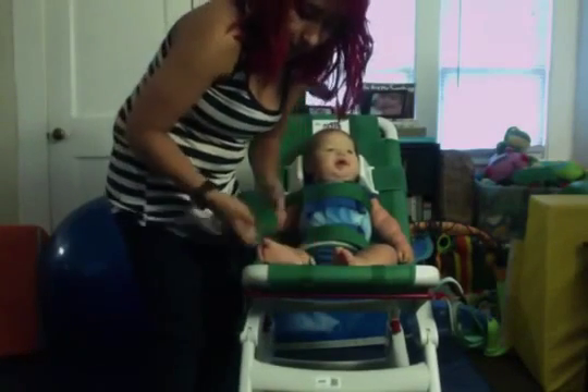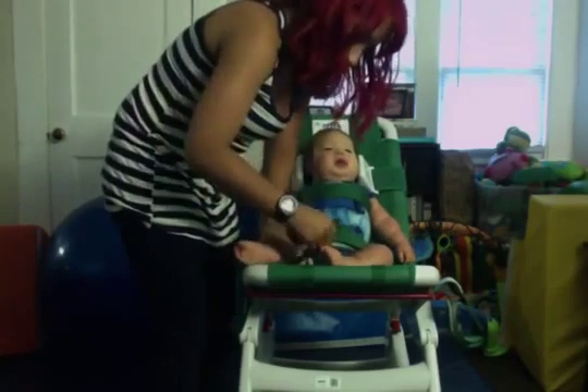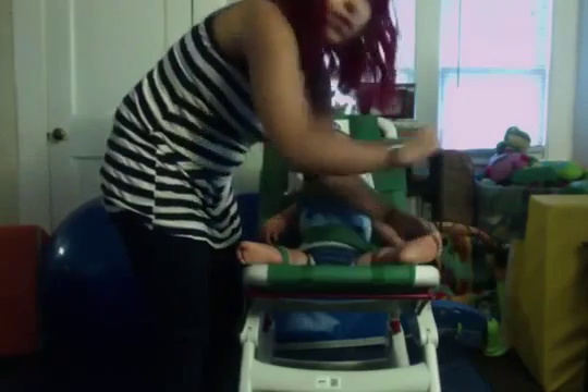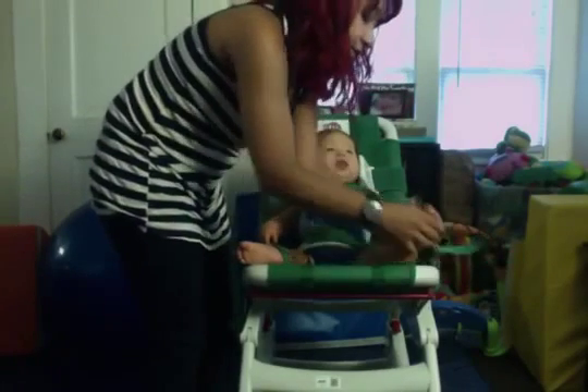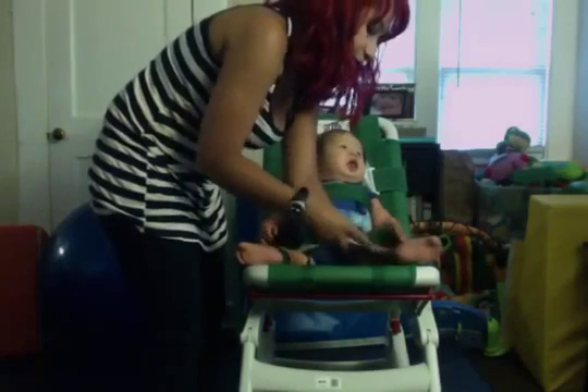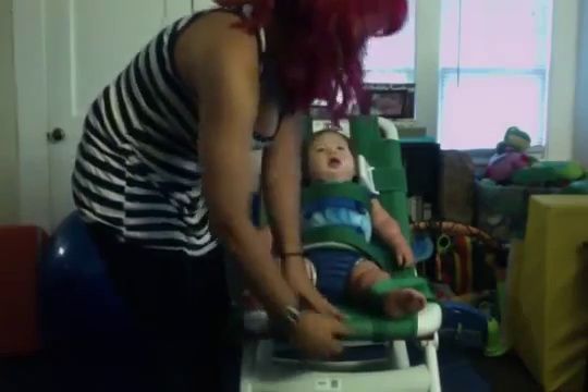If you want, you can use the foot straps too. We don't use them a whole lot — I just don't feel they're completely necessary for him. Maybe for children that do quite a bit of moving, but he doesn't move very much. So that's what it looks like with him in the chair.